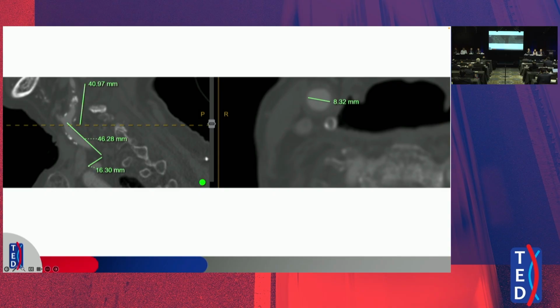I was part of the study for Performance 3. The question then was, and the whole determination of using a filter and a balloon and a stent, like a 3-in-1 system, even though we did do reversal of flow, is this the ideal way?